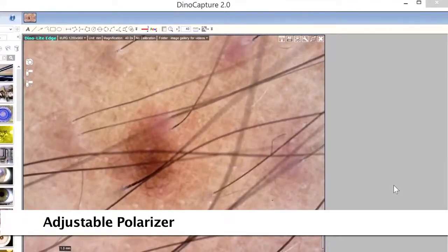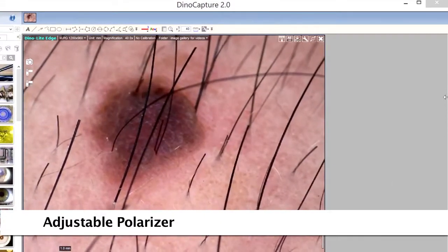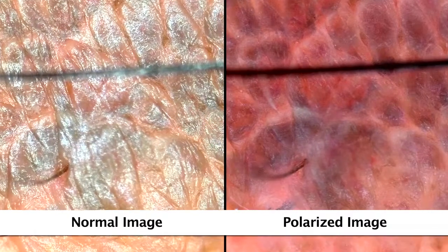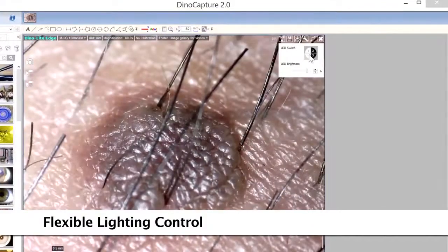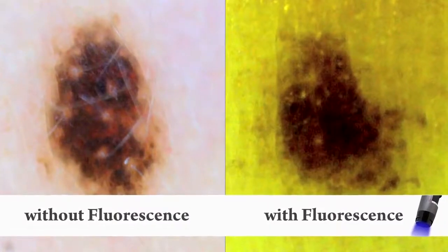Some models have a built-on adjustable polarizer that helps provide more clarity and different results in imaging. There are also different fluorescent models to choose from with varying wavelengths.